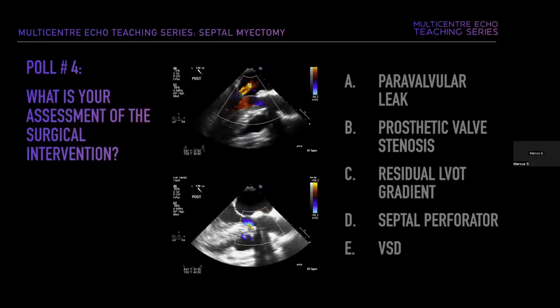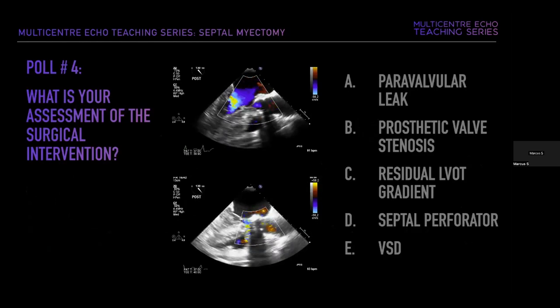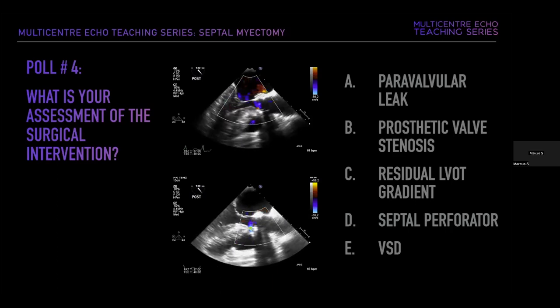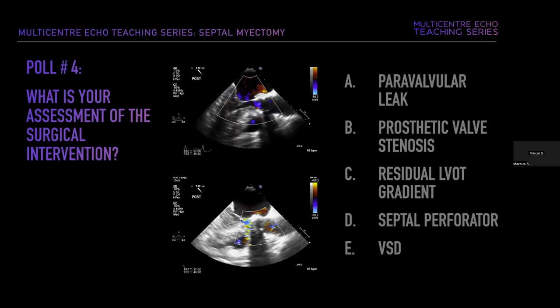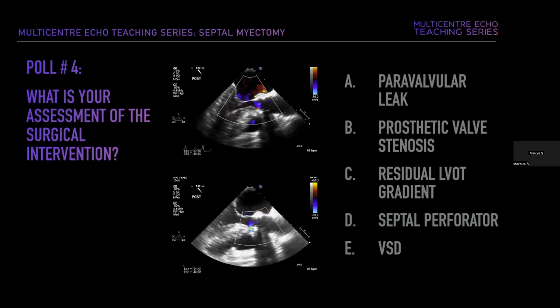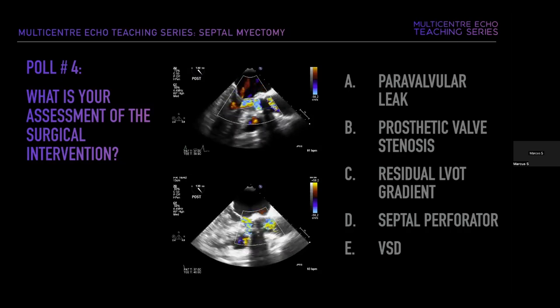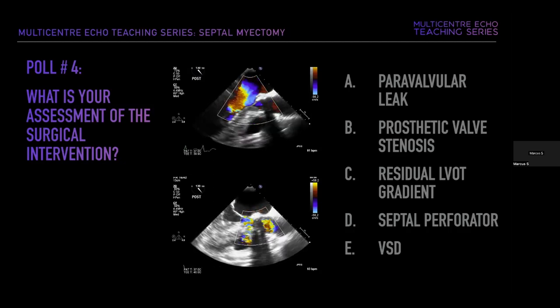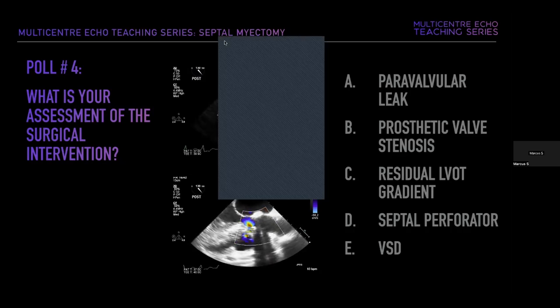Poll: what is your assessment of the surgical intervention? Options include paravalvular leak, prosthetic valve stenosis or stuck leaflet, residual LVOT gradient, septal perforator, or iatrogenic VSD. 81% of respondents correctly identified this as a VSD. Color interrogation in the midesophageal four-chamber view clearly shows a restrictive VSD in the perimembranous region at the site of the myectomy, measuring 0.6 centimeters. A freeze frame confirms the size and continuous wave Doppler demonstrates peak velocities over 4 meters per second.